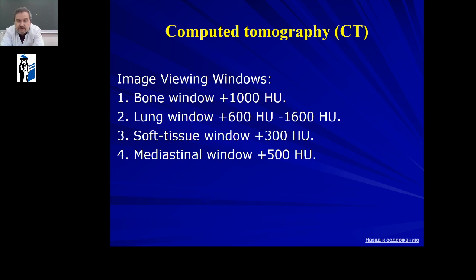In the workstation of radiologist of computer tomography, or in special software for viewing DICOM files, we have to choose different image viewing windows to better view some organs.